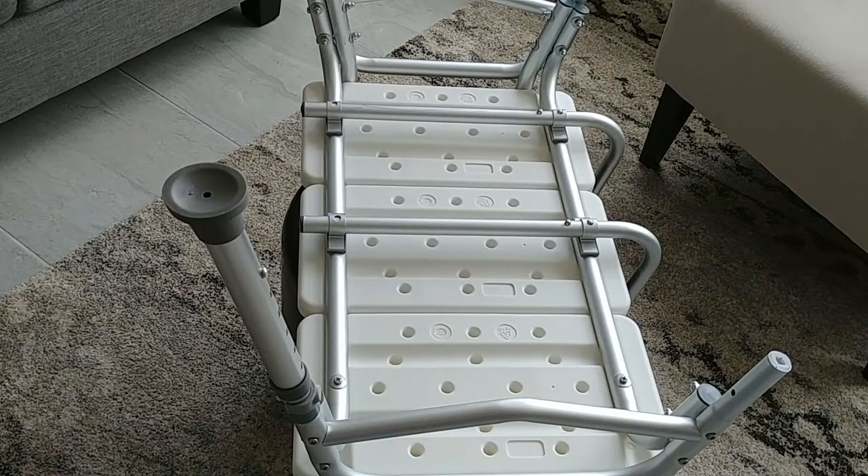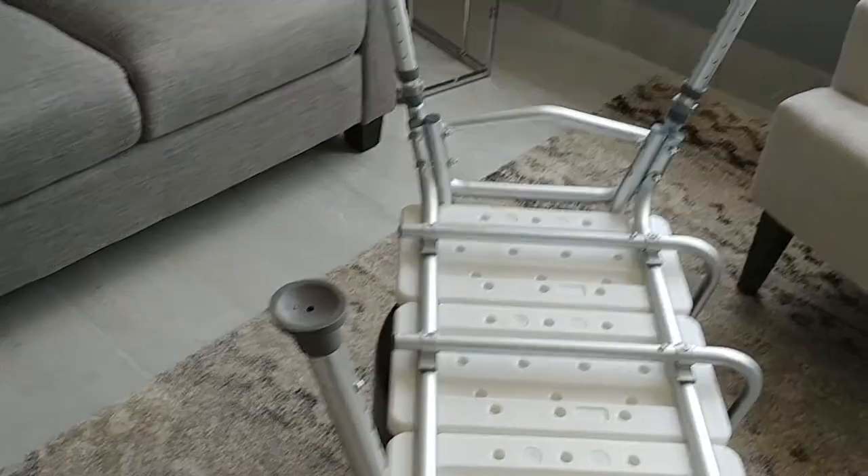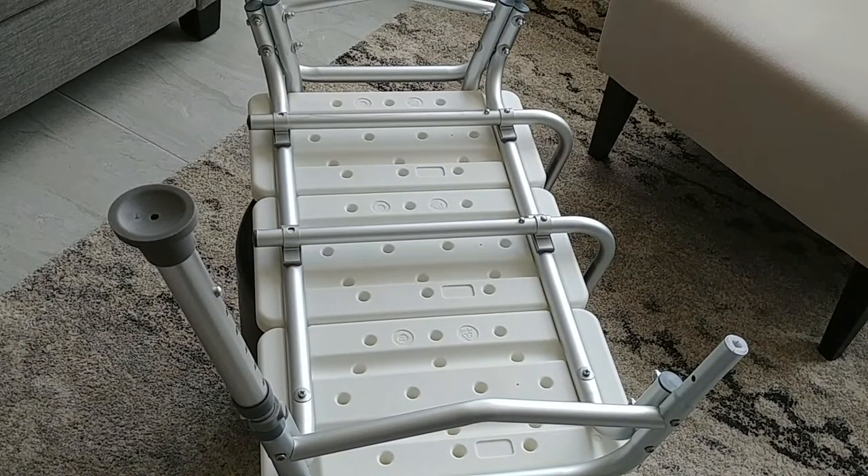I'm going to put together a quick video here on assembling the Vive Transfer Bench. I've got it mostly assembled now. You'll see the suction cup legs are on it there, the non-suction cup legs are on it there. There's one leg that I've got missing because it's in my hand here.